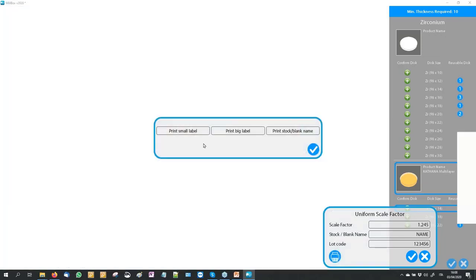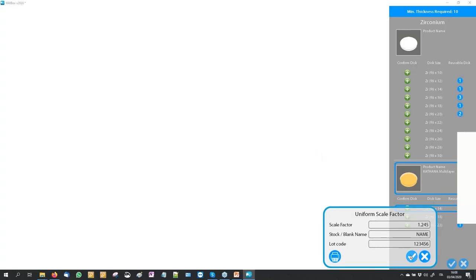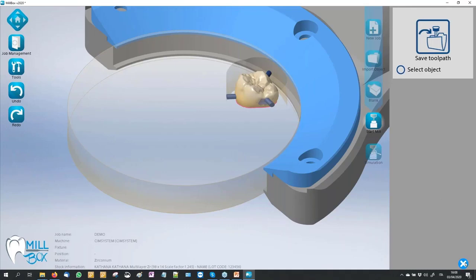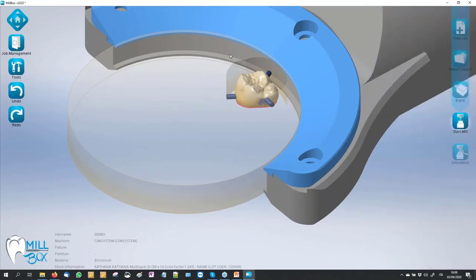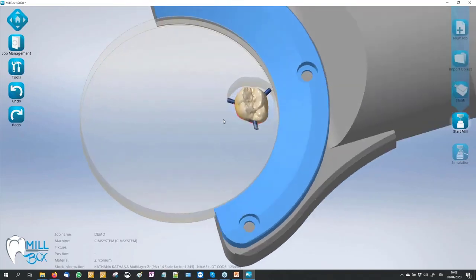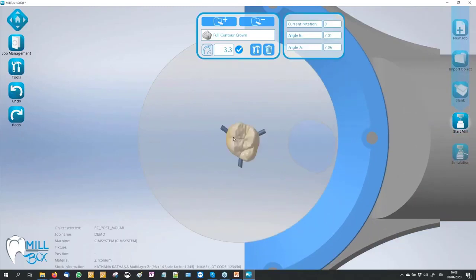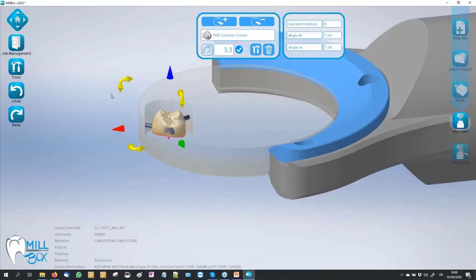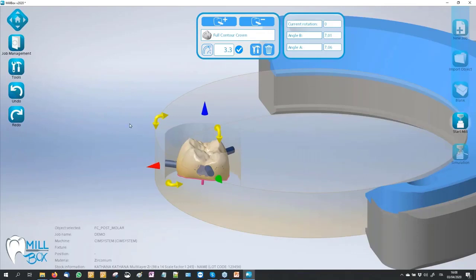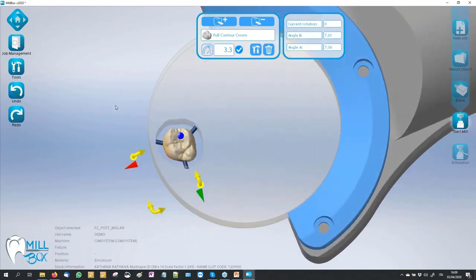We have also introduced the possibility to print a label — a little code that we can glue on the lateral wall of our stock. We can read this code with our webcam; it is not necessary to buy special hardware. It's possible of course to move our job, and if everything is okay we are ready to start our calculation. You can see how fast it is to be ready.